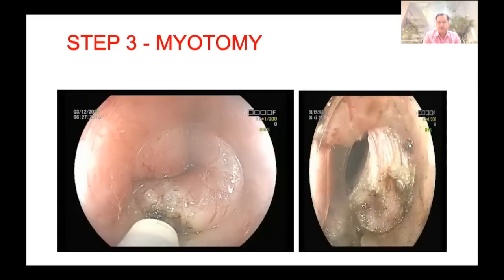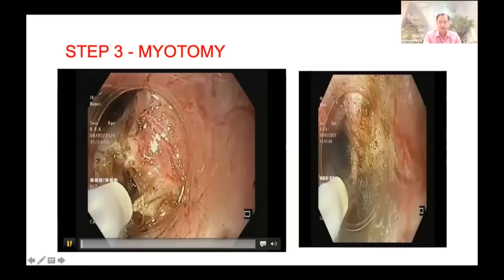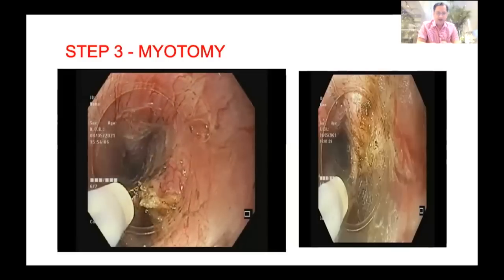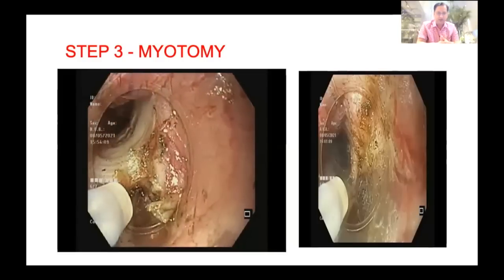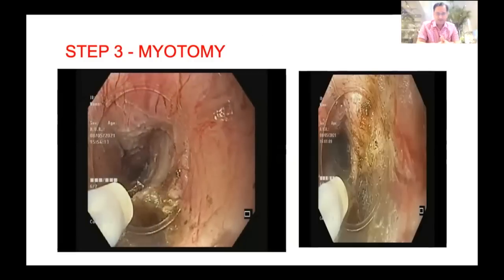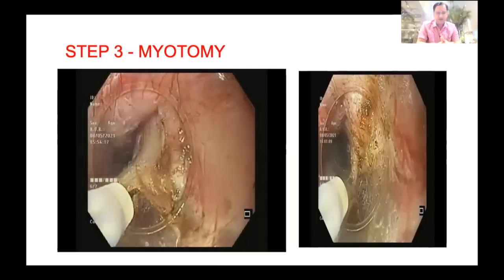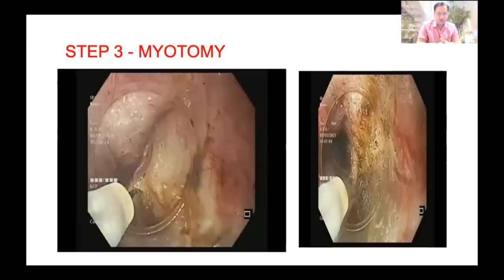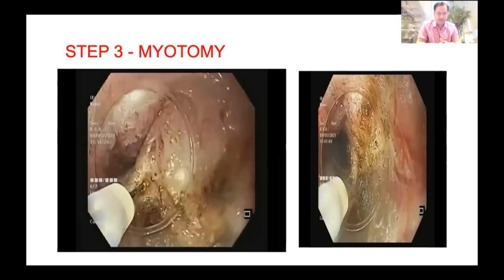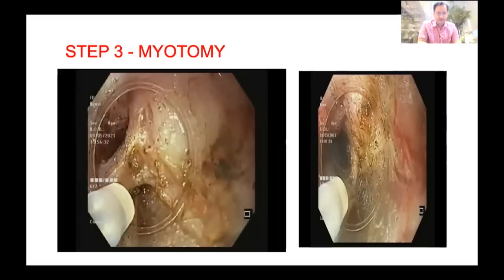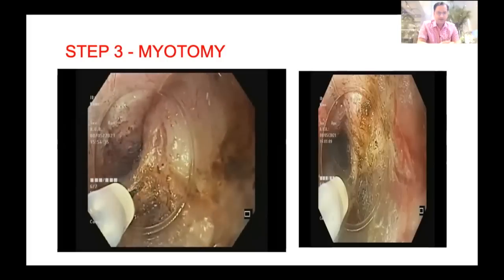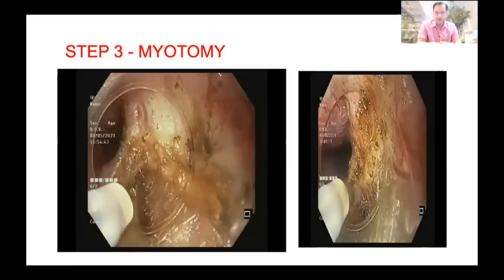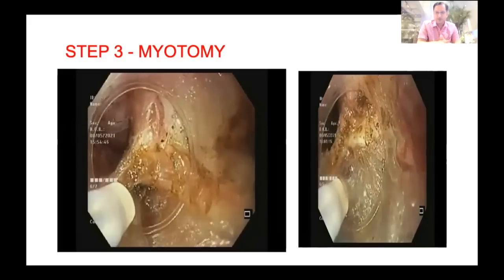I am extending this myotomy incision into the stomach. After identifying the correct plane of myotomy, the myotomy becomes very easy — just apply force with the TT knife with a few strokes of coagulation current, then cut current. Extending till the GE junction, you can see absolutely clean myotomy. Once you reach the GE junction, perform a complete myotomy using coagulation current only. You can also notice the perigastric fat.